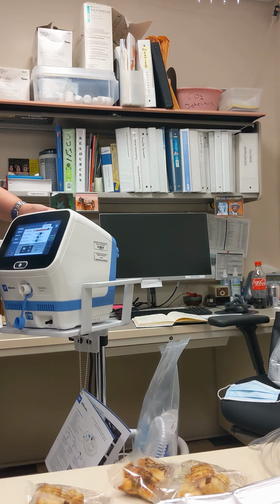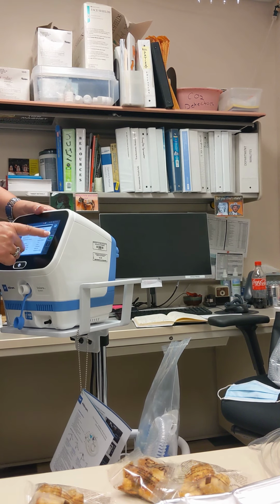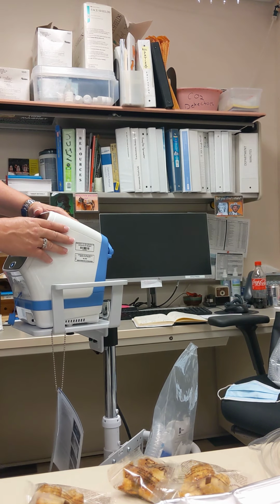4345, enter. Then you can go in and change your peak pressures. You could go into automatic mode. You could put in custom care plans for your patients if you find out you're using this regularly. You know what I mean? And it just makes sense.